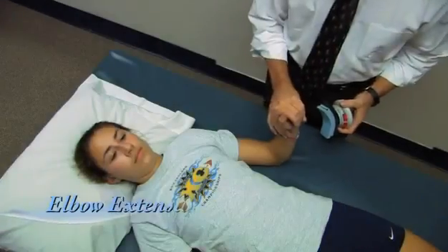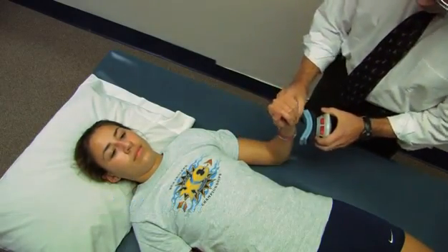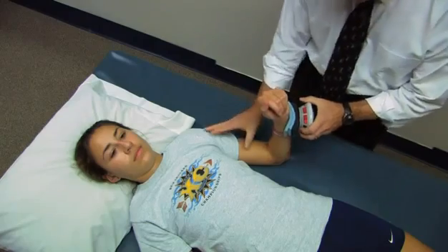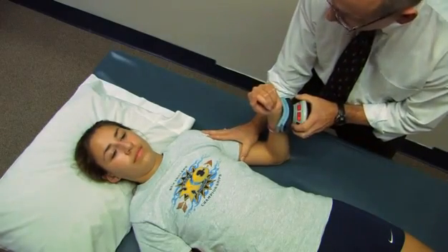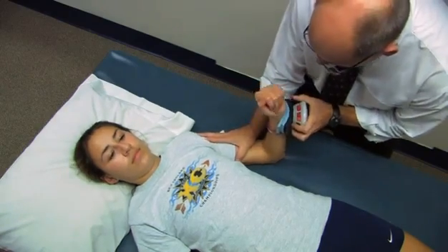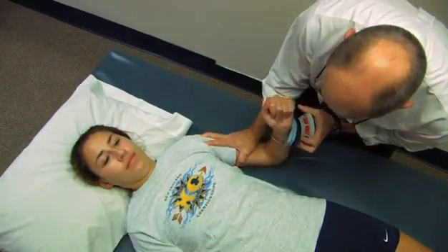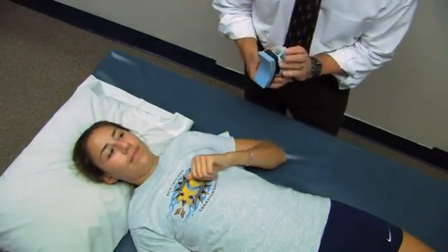Now we're going to measure elbow extension. Again, arm slightly away from the body, elbow at 90 degrees, placing the device just proximal to the styloids. When I say go, you're going to take a second or two to your best effort, then continue until I say stop. Go ahead — straighten it out, harder, harder. And relax. 23 pounds.